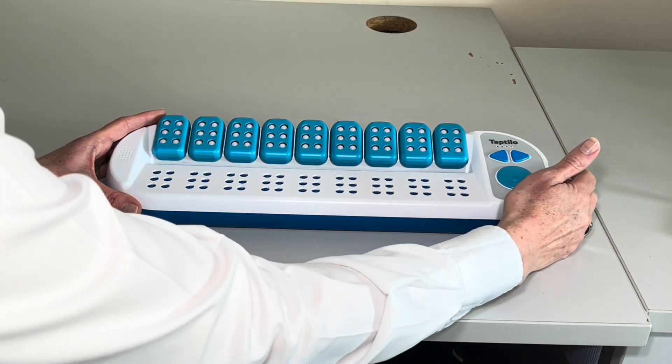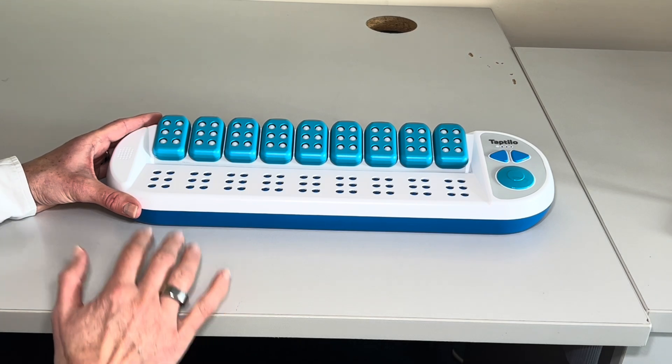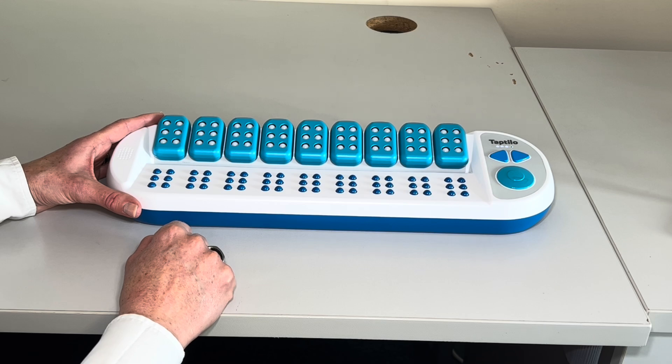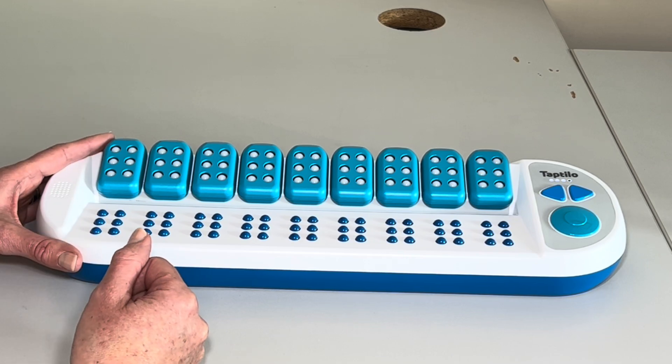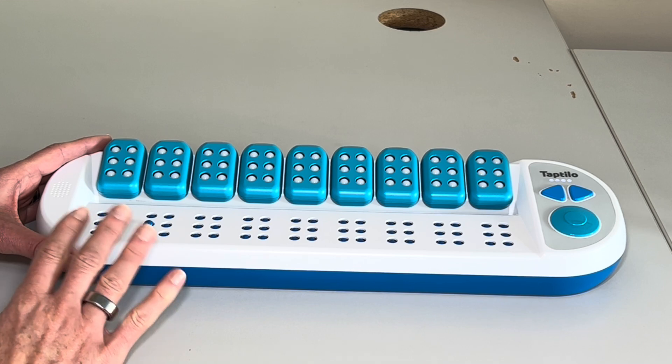So the TapTilo, if I switch it on here — the TapTilo can be used for self-study just with the device itself, or it can be used in conjunction with an app on iPhone or Android for a teacher to control. For teaching mode, pair with the TapTilo application. For self-study mode, press the circle button. So we'll look at self-study mode first, so I'm going to press the circle button. Self-study mode.